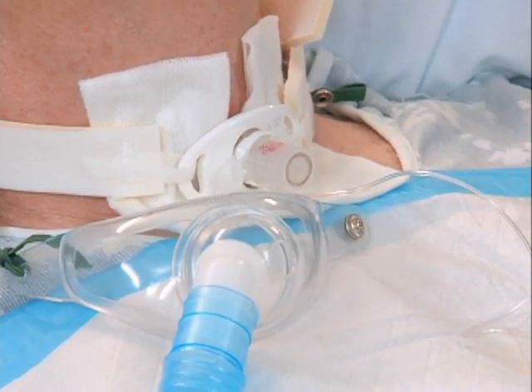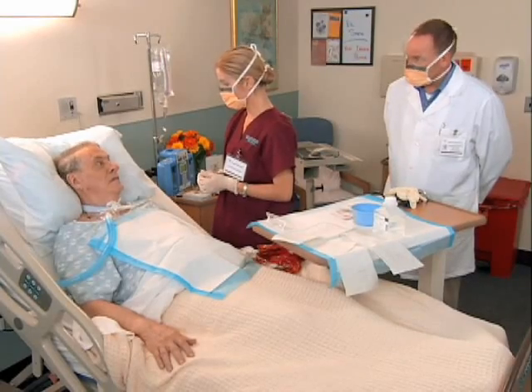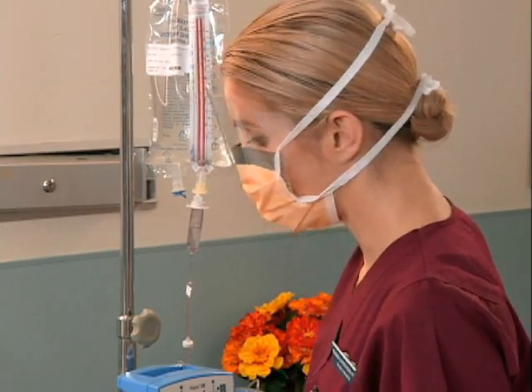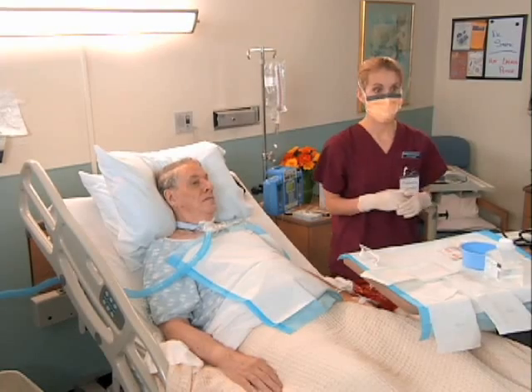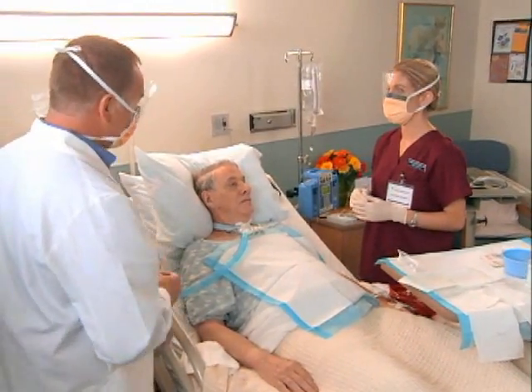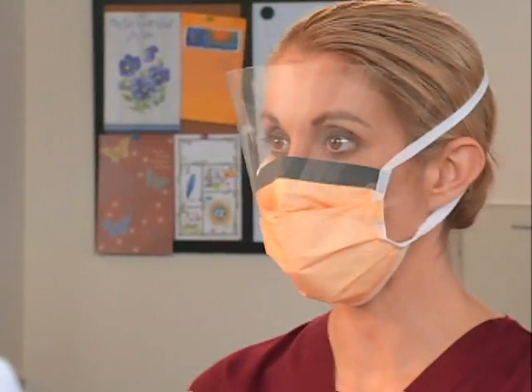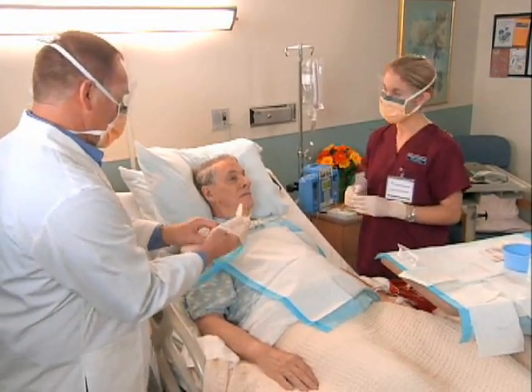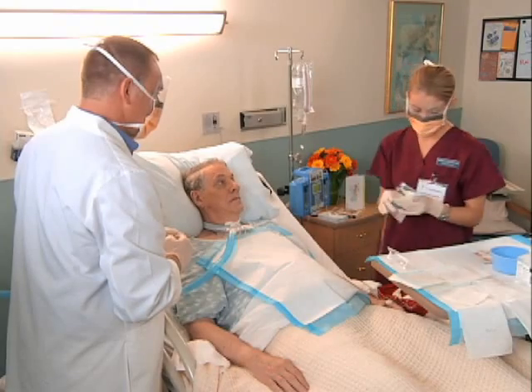Okay, all done. Now I'm going to change your tracheostomy holder, Mr. Marks, okay? But for that, I'm going to need the help of a second nurse. Okay, Mr. McDaniel? Okay, Marissa, talk me through what you want me to do. Just hold the tracheostomy tube in place while I remove the old collar and place the new one. First, I'll put on some gloves. Ready? Okay, here we go.